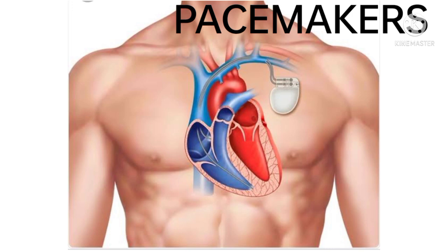Types of permanent pacemaker: 1. Single chamber pacemaker. In this type, only one pacing lead is placed into a chamber of the heart, either the atrium or the ventricle. 2. Dual chamber pacemaker. Wires are placed into two chambers of the heart. One lead paces the atrium and one paces the ventricle. Closely resembles the natural pacing of the heart. 3. Rate responsive pacemaker. It has sensors that detect changes in the patient's physical activity and automatically adjust the pacing rate to fulfill the patient's metabolic needs.